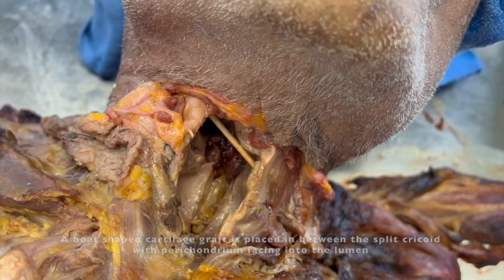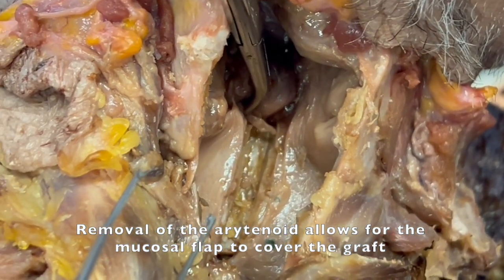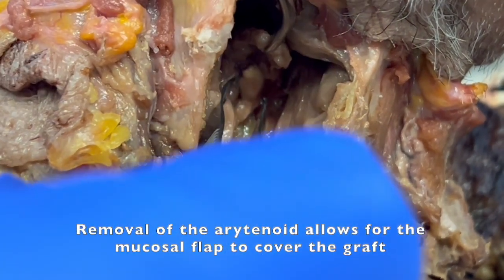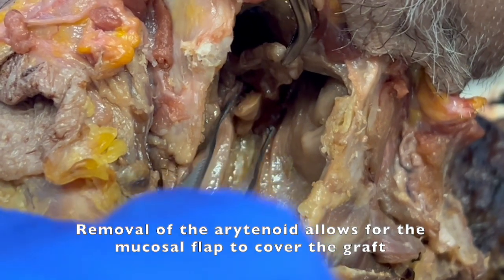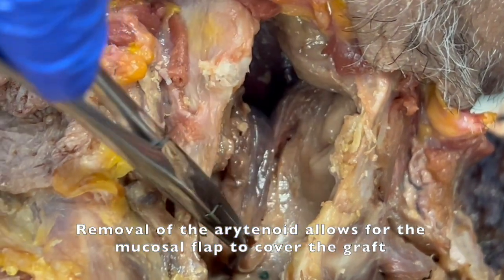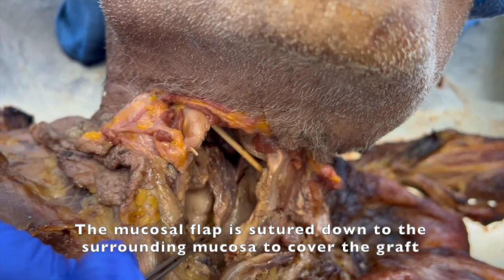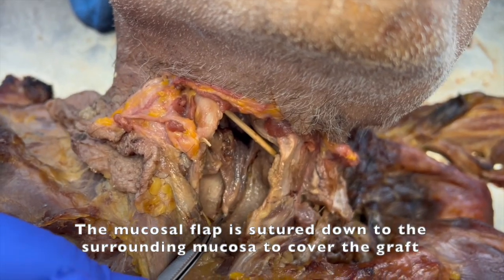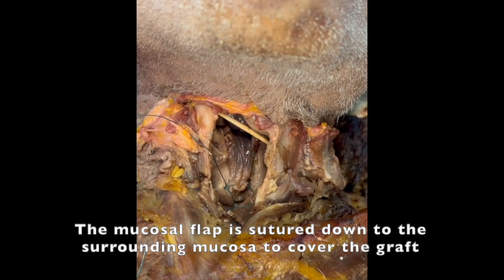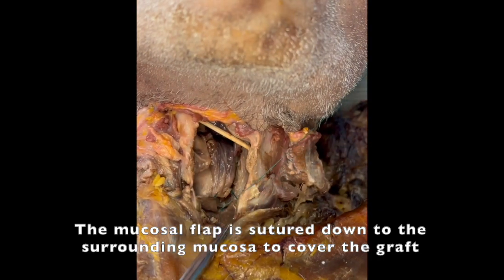Here you can see the graft in place. Once the cartilage is removed, the mucosal flap is folded downward all the way to the inferior portion of the cricoid cartilage, covering the arytenoid cartilage site. The mucosal flap is then sutured over the cartilage using 3-0 vicryl sutures.